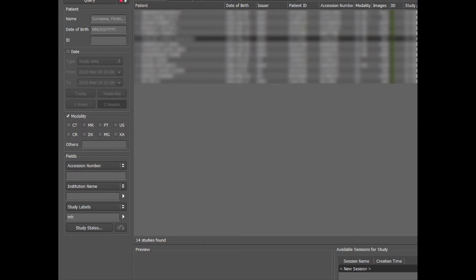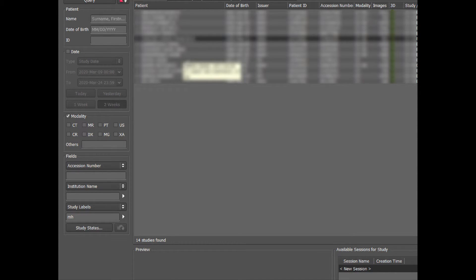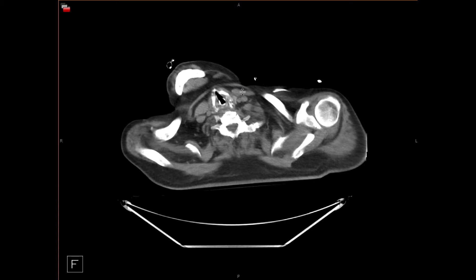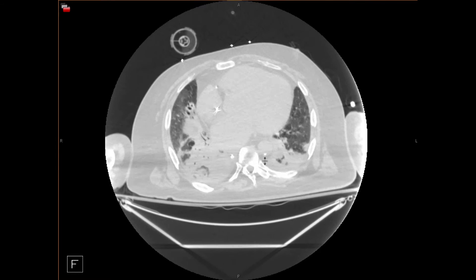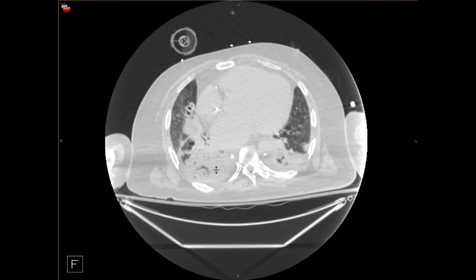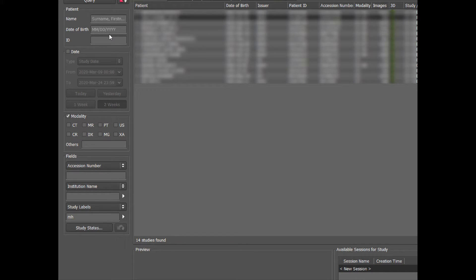Other entities also give the reverse halo sign in infections. This can be seen in bacterial pneumonias — we've particularly noticed this in Klebsiella pneumonia. Here we see a large dense area of consolidation in the right lower lobe with central clearing that later went on to cavitate. This was Klebsiella pneumonia in a non-immunocompromised patient, so we did not suggest invasive fungal infection as the etiology.